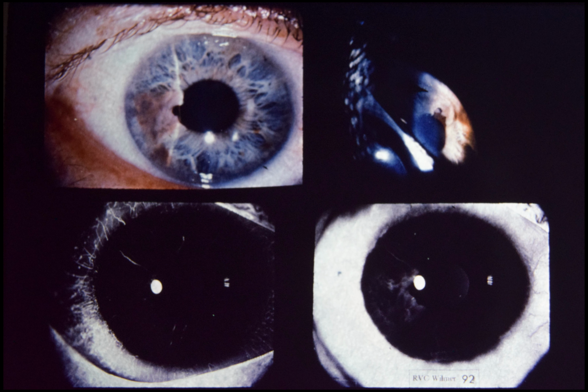Lower left, 30 seconds after dye injection, note fluorescence from abnormal vessels which were not visible by slit lamp examination. Lower right, 15 minutes after injection, note dye leakage from vessels in tumor and absence of leakage from iris vessels away from tumor. Comment: this patient has been followed with serial photographs at 6-month intervals for the past 4 years and has demonstrated no growth of the lesion. Unless growth is documented by photography or unless involvement of the angle occurs, treatment will be deferred.